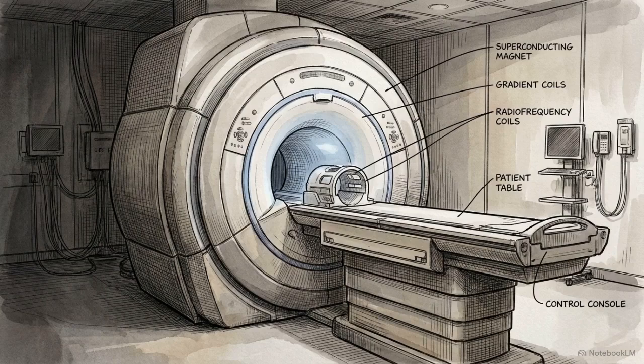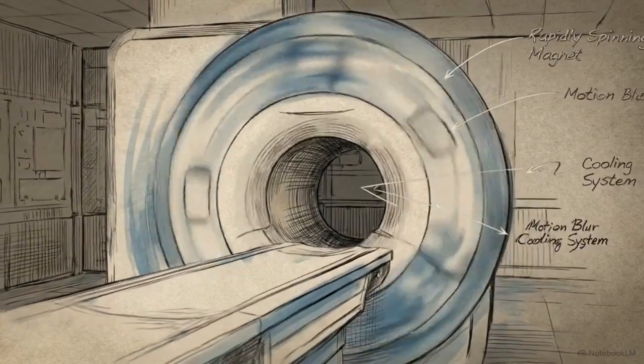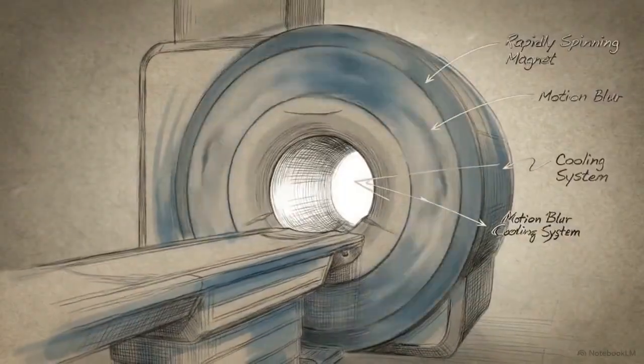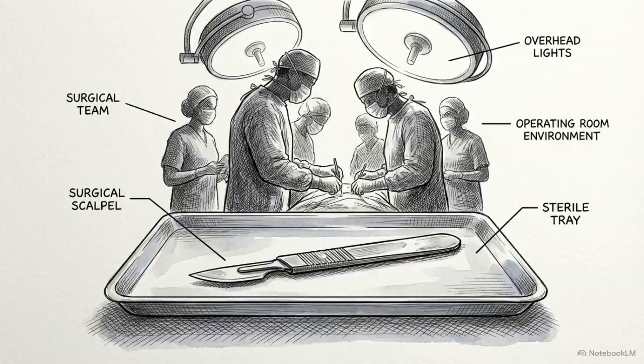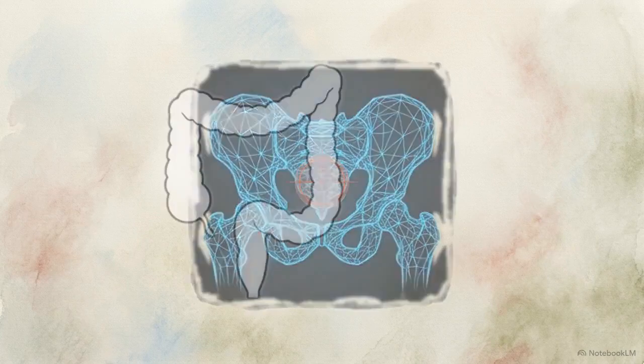The management of rectal cancer is currently splitting into two distinct pathways. For tumors in the lower rectum, protocols increasingly demand intense neoadjuvant therapy, a combination of chemotherapy and radiation administered before surgery. Conversely, patients with upper rectal tumors are increasingly skipping radiation and proceeding straight to surgical resection. Deciding which pathway a patient takes relies entirely on accurately locating the tumor.